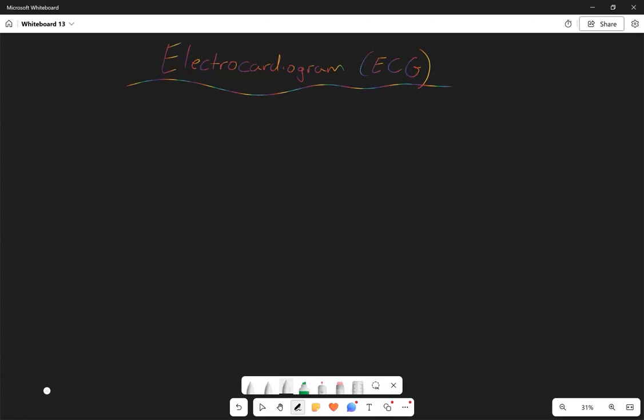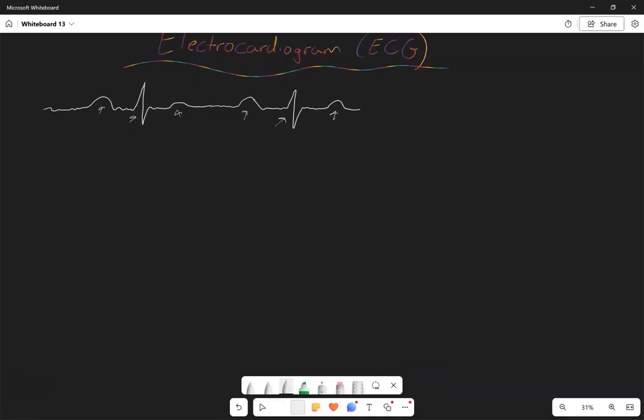All right. So when you look at it, you'll probably recognize something that maybe looks like this, right? You'll see this a lot when you look up sort of cardiac physiology, right? You look up EKG, ECG, it's going to look something like this, right? But what creates these waves in your ECG? Okay, well, that's how we're measuring the electrical conductivity through the heart.